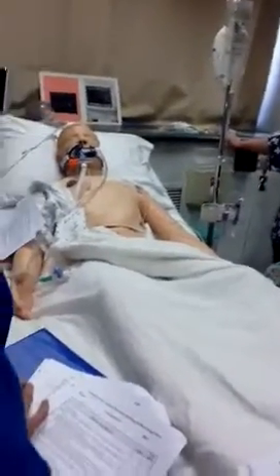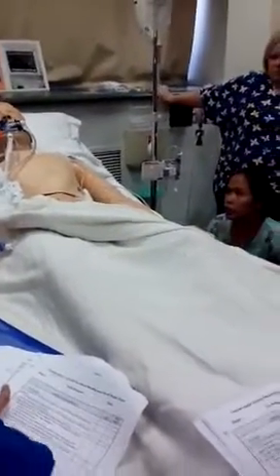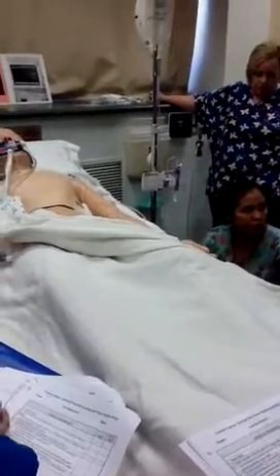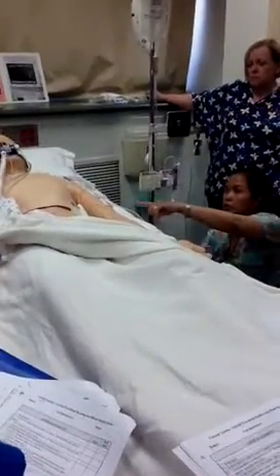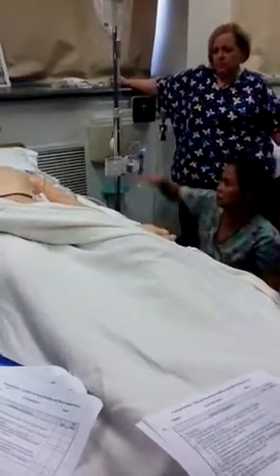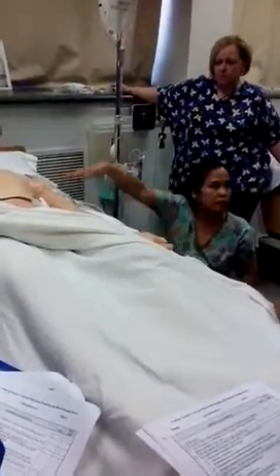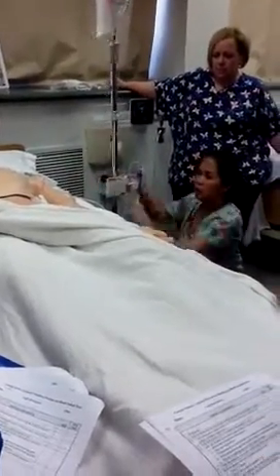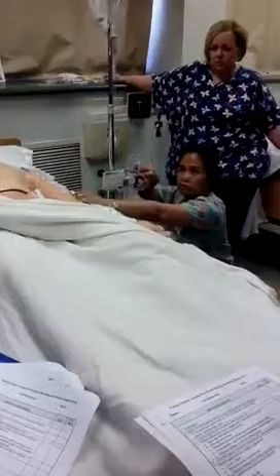And for prevention of ventilator-associated pneumonia, you want your patient's head of the bed elevated at 45 unless it's contraindicated, correct? So see how this one is? Now look where this is. If you put your patient's head down, look where we're leveling. So you want to lower this, and you unscrew it, and you level it, and then you do the zeroing again.